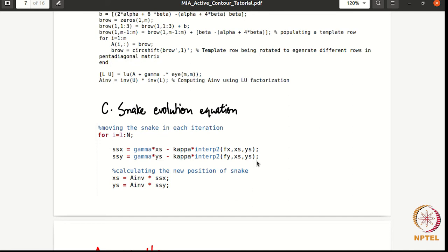You will be able to see a pentadiagonal system. You will see people calculate some external forces. Now, what is the external force? This depends on their energy functional, but it will be there. So you will be using some gradient, etc. So not a problem. Even if you have just one MATLAB code, you can modify it to suit your purpose.